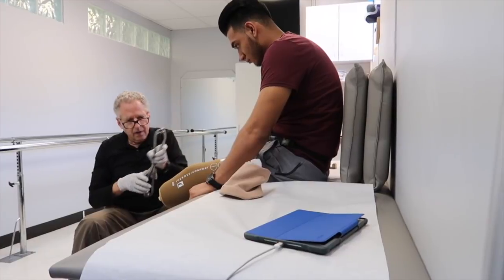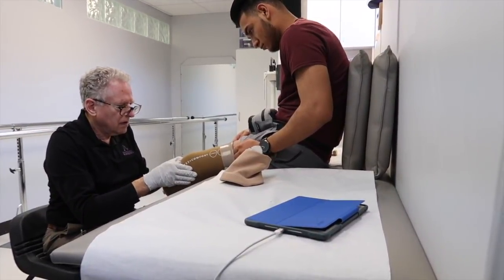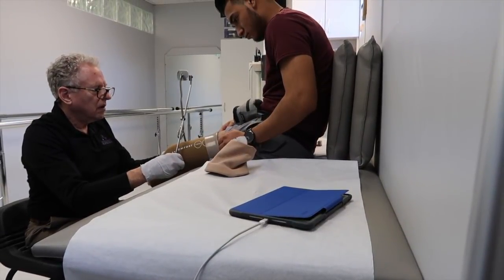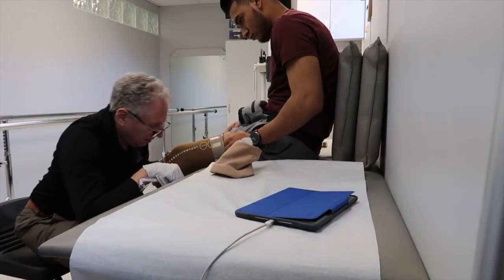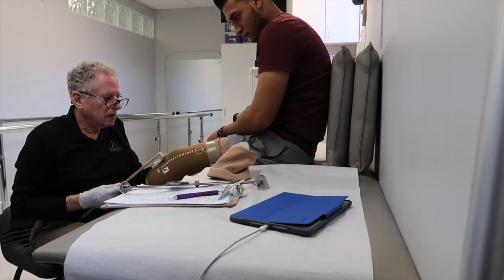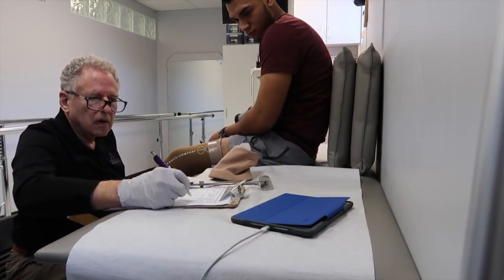I'm just gonna try to explain as we go here because it does get a little confusing, so I just want you guys to understand what's going on. As we see right there, he's trying to find my patella tendon, then he's gonna measure my lateral collateral ligament to my medial collateral ligament, then he's gonna go from my patella tendon to the back of my leg to find a good thickness. Then he goes from my patella tendon to the end of my stump just to get an overall length of what I have left on my leg, and then he's gonna write it down to keep that as a record.